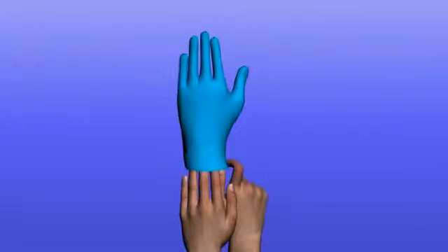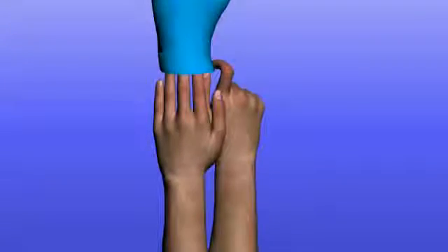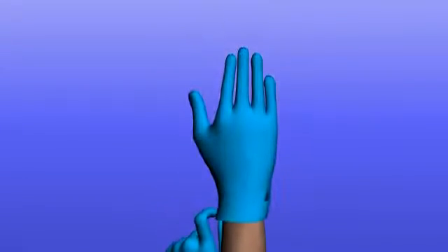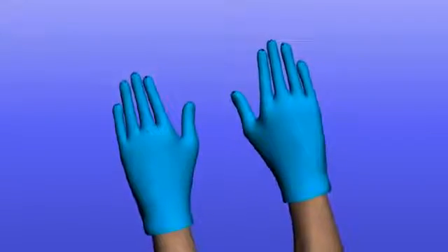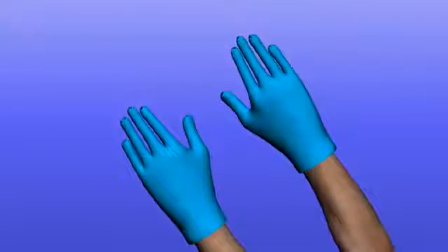Placing a new dressing. Put on the second pair of gloves included in the procedure pack. Pick up one glove by the wrist and put it on. Pick up the other glove by the wrist and put it on the other hand. Both gloves fit either hand. Be careful not to let the outside of the gloves come in contact with anything non-sterile, for example clothing or skin.